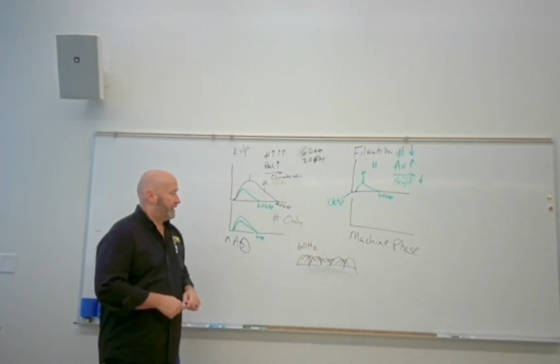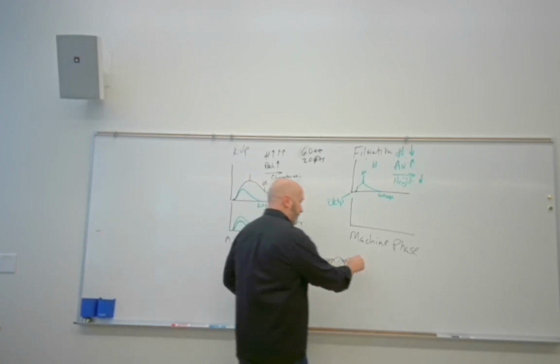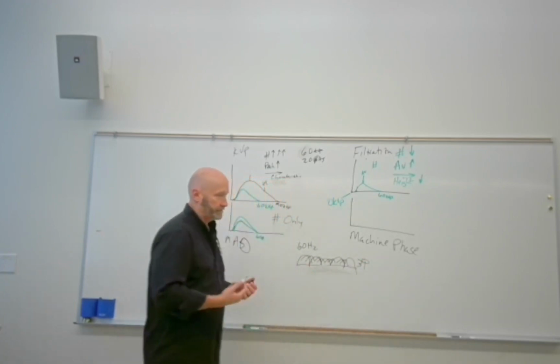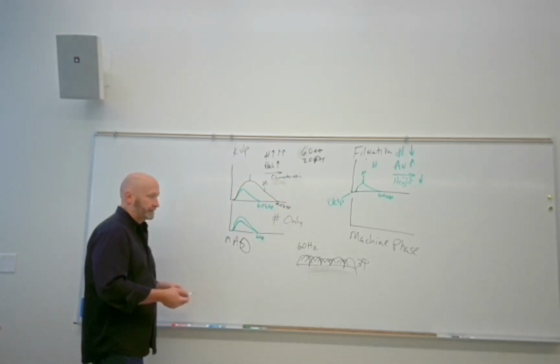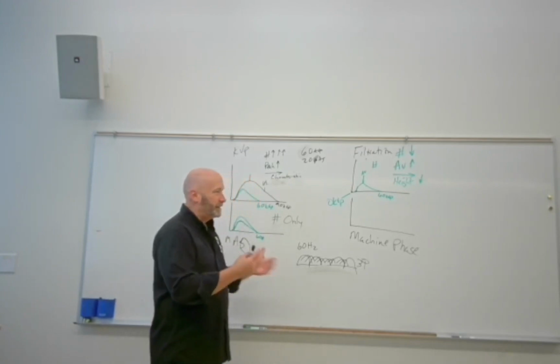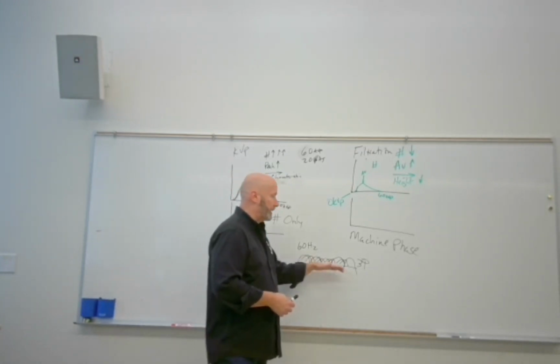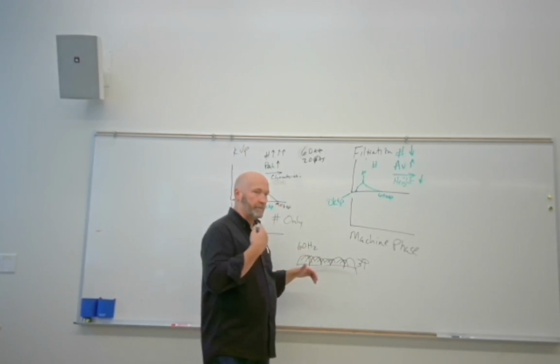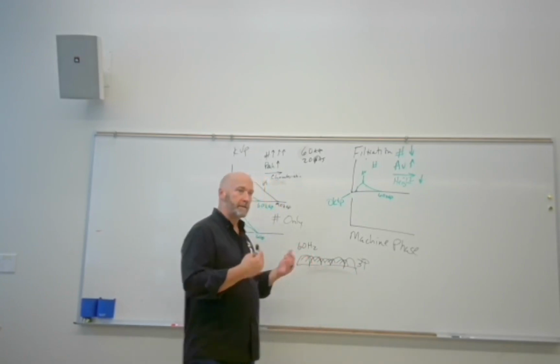All right. So this would be 3-phase, 6 pulse, and you also have 3-phase, 12 pulse. I'll talk about how all that happens, but at any rate, with 3-phase our voltage ripple never comes to a stop. It never ends, right?